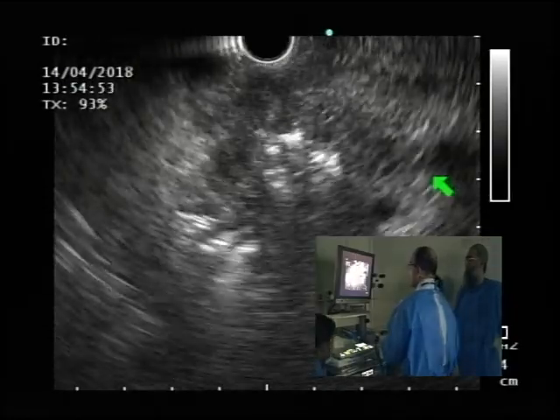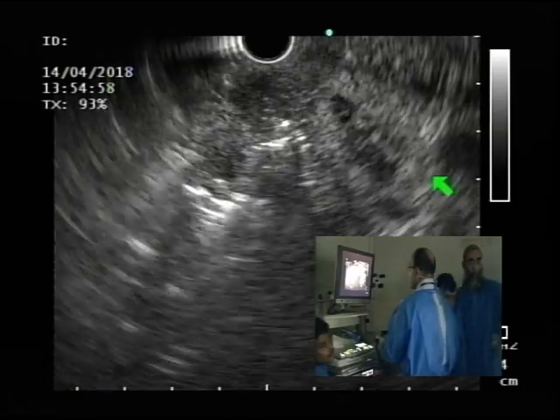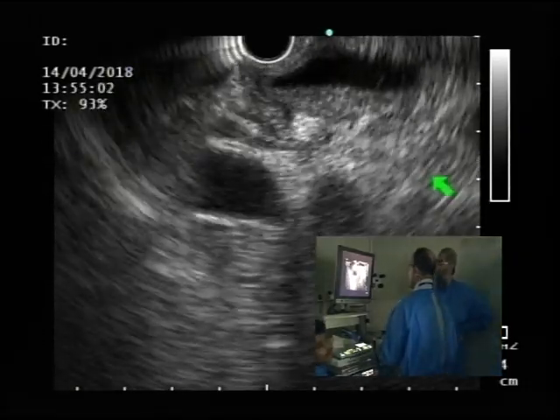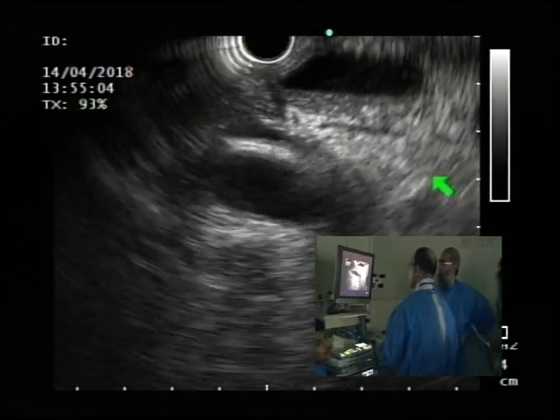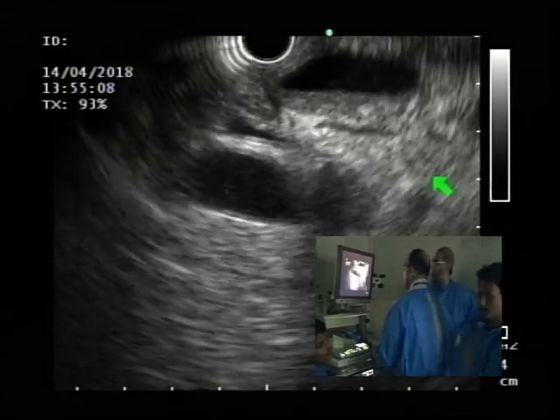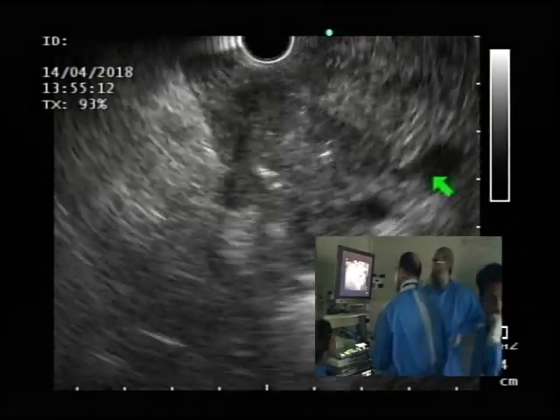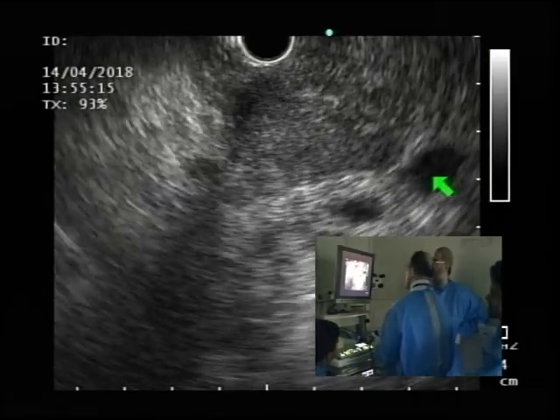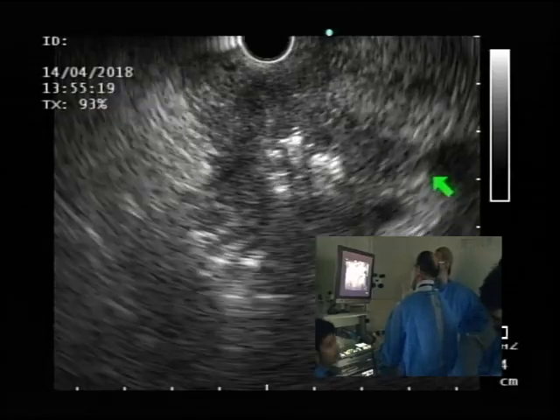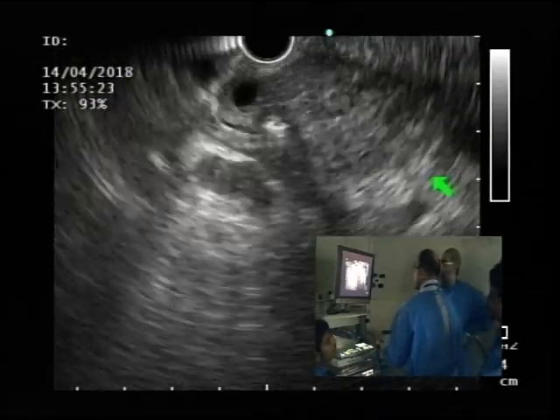And here we see this large mass with what you'll see is the pancreatic duct right there. And then as we go more counter, you see the bile duct. So bile duct dilated with debris in it. And as I go more clockwise, you can see the pancreatic duct is involved too. It's not significantly obstructed. We know that from the body image that the duct was not markedly dilated. But it's going to eventually be involved and get obstructed.